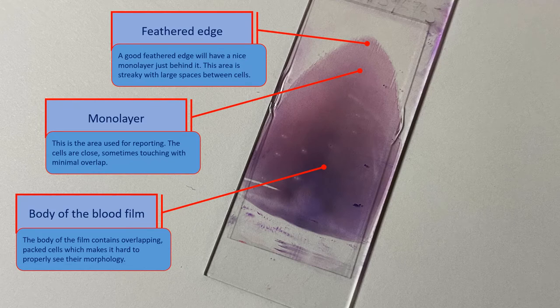When reporting, we are most interested in the monolayer, as the body contains a large number of packed cells, many of which are overlapping or squished together, making it difficult to discern the morphology.